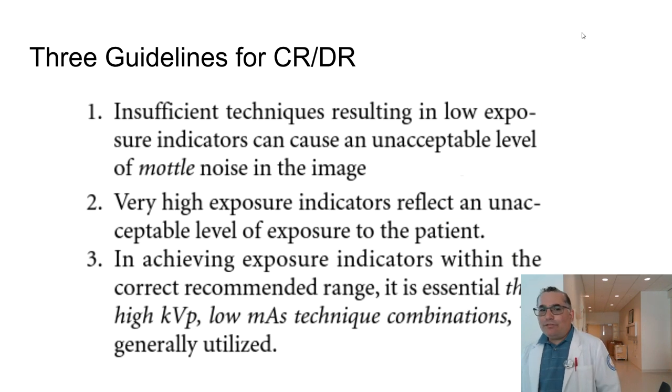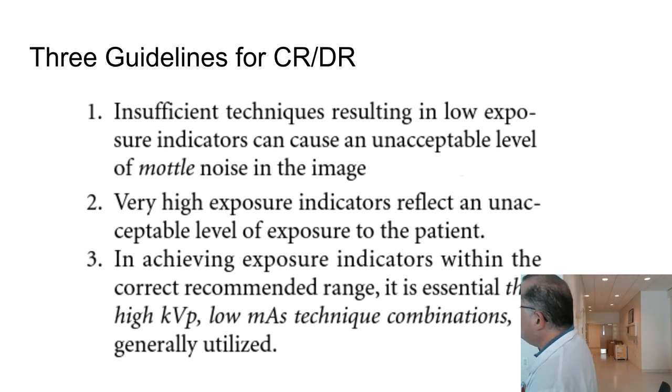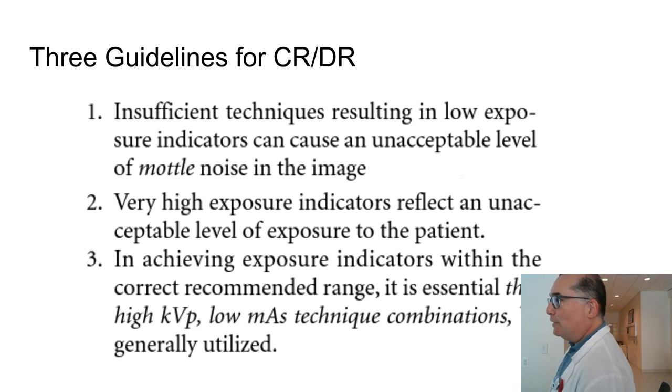And we've discussed some of these guidelines, right? Probably the biggest one is number one. This goes for DR as well as CR, and that is if we don't have enough exposure, right? In other words, a low exposure, not necessarily a low exposure indicator, because in CR it's the opposite, right? When the number's high, that's when you have had a lower exposure.